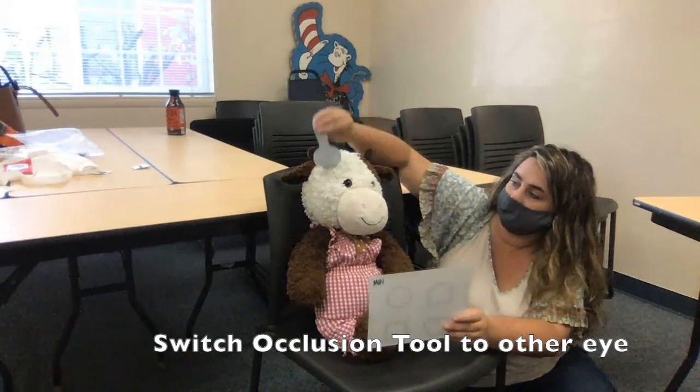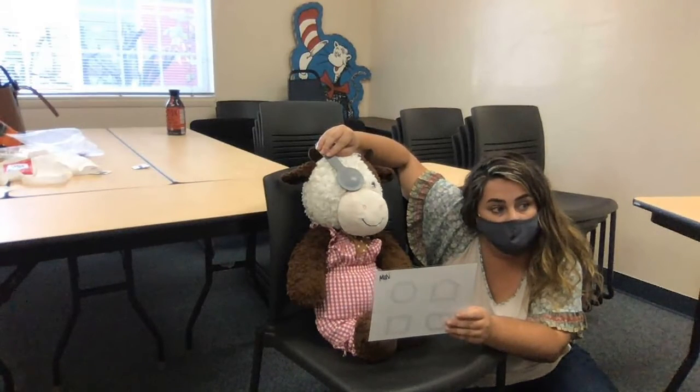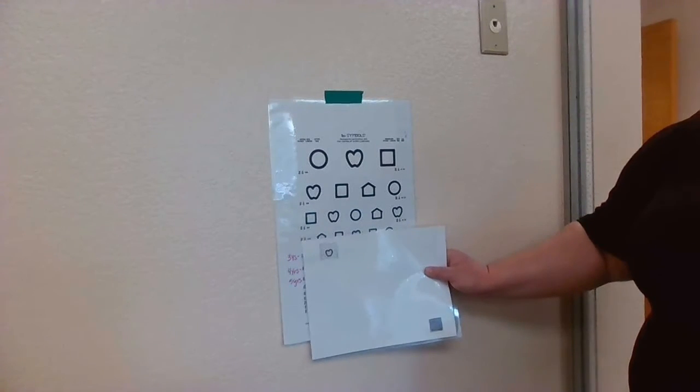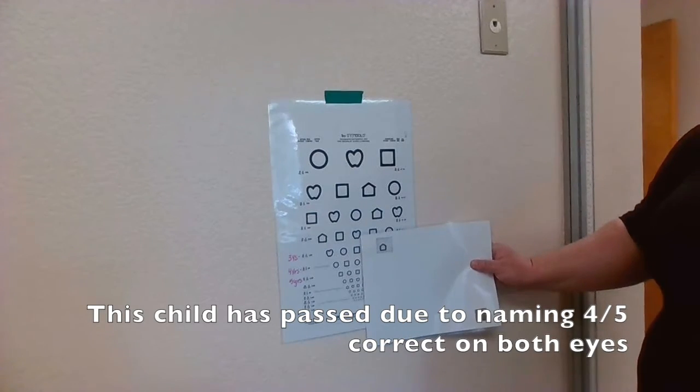Switch occlusion tool to the other eye and go through the same process, allowing the child to identify the shapes verbally or by pointing at the response card. Beginning again at the age-appropriate line, move from shape to shape as the child identifies it. As long as they get 4 out of 5 correct, they pass.